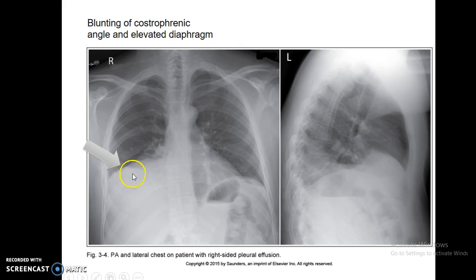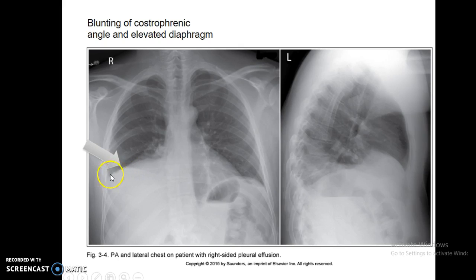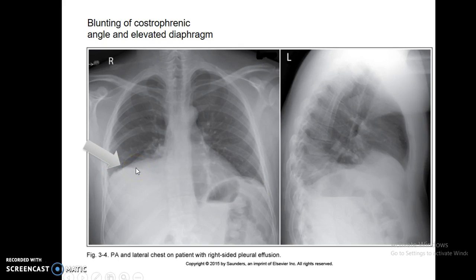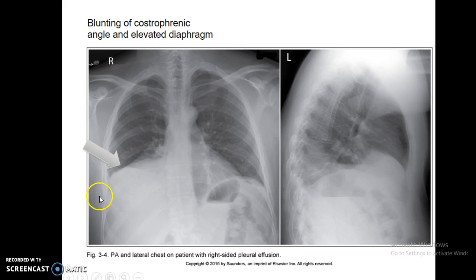Blunting is not a big problem, but when you do not get a good inspiration this could be a potential problem. If you imagine this done on expiration instead of inspiration, you would not be able to tell if it's just the hemi-diaphragm coming up or if there's actually some blunting at the costophrenic angle because of an elevated diaphragm.